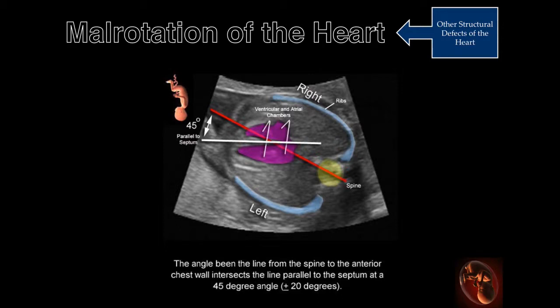In the normal fetus, the interventricular septum lies 45 degrees from a line drawn from the spine to the anterior chest wall. The normal position of the heart is plus or minus 20 degrees from the position of the septum in this image. If the septum deviates more than 20 degrees, malrotation must be considered. Malrotated hearts are often associated with structural abnormalities.